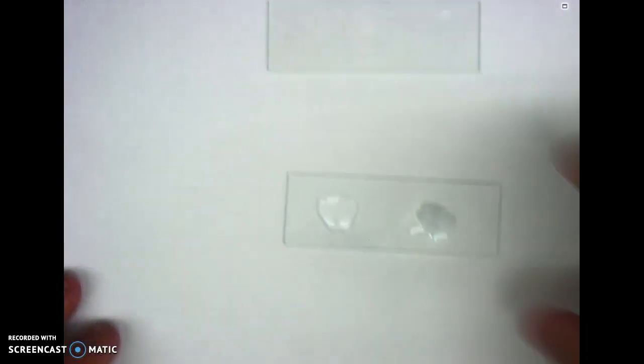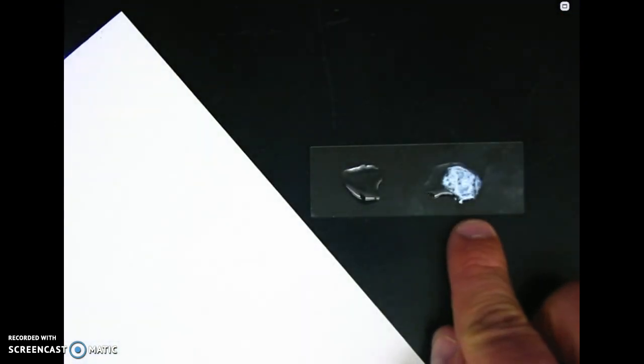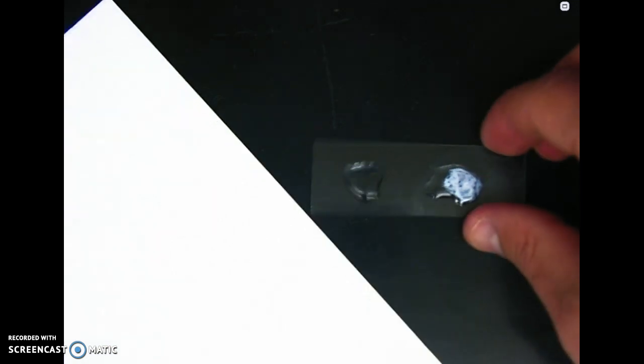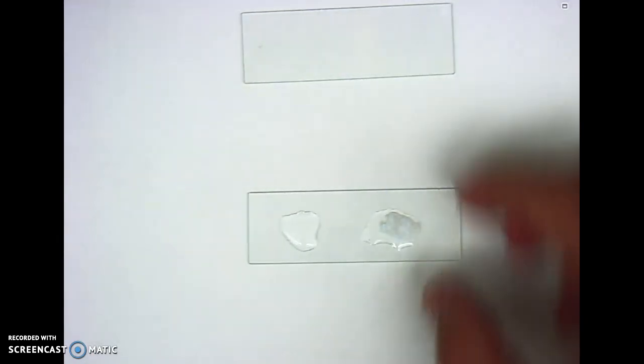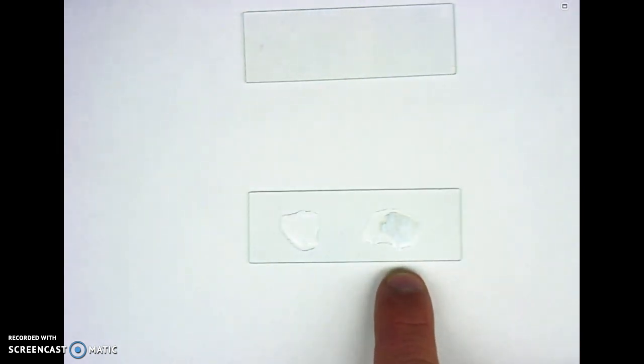From this view, you probably can't see much, so I'm going to change the background to give you a better sense. Keep it on the right: this one did change color. I had two colors, now I have a different color on the right. This one stayed the same. That's important. That's what you're going to be putting into your data table, recognizing when and where the color change occurred. From this information, that simulated change right here indicates a clot occurred.